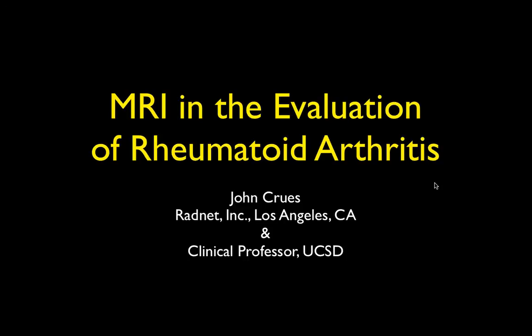and that's because there are no studies that have been done properly to show a role for MR. Just like in the early days of arthroscopy, if everybody goes ahead and has surgery, then it's not going to be cost effective. What happened is that Yale, and then the study that we did with the AAOS, which the AAOS decided not to publish, showed that MR was cost effective in a plausible clinical setting.